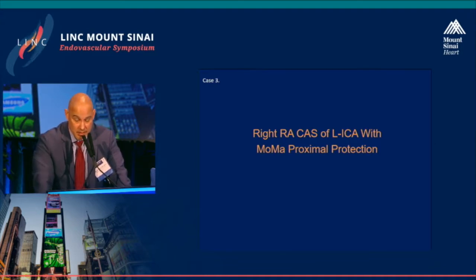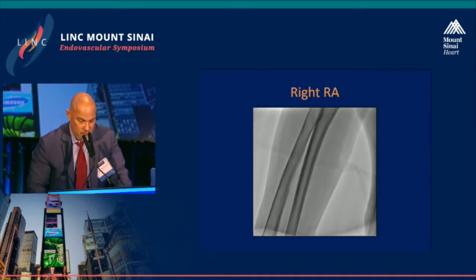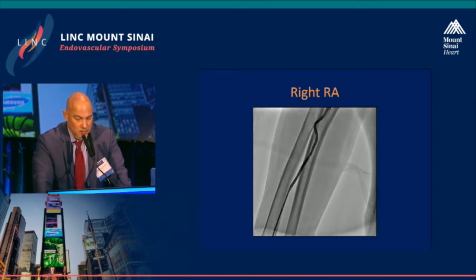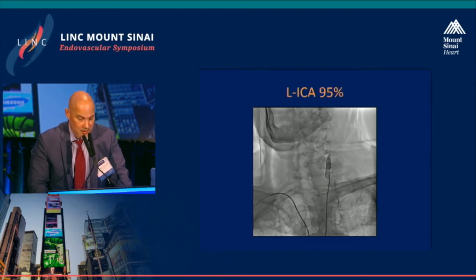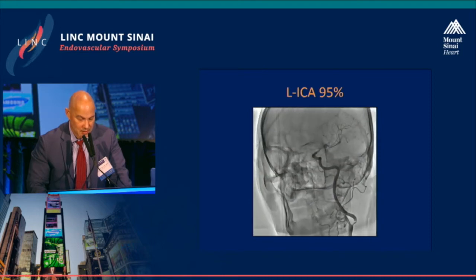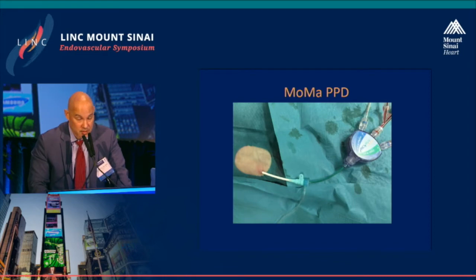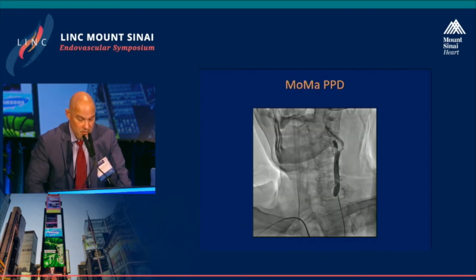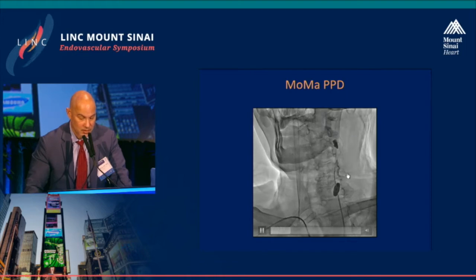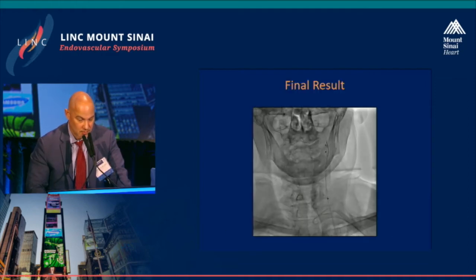The next case was borrowed from a colleague from Skopje: right radial carotid stenting of a left internal carotid utilizing a proximal protection device. This demonstrates a robust right radial artery. A Simmons 2 catheter is advanced to the left internal carotid artery, a wire is advanced to the left external carotid, and then a MoMA proximal protection device is advanced. With proximal balloon inflation and distal balloon inflation in the external carotid, there is no antegrade flow except what is injected through the catheter. This is the final result after debris retrieval.